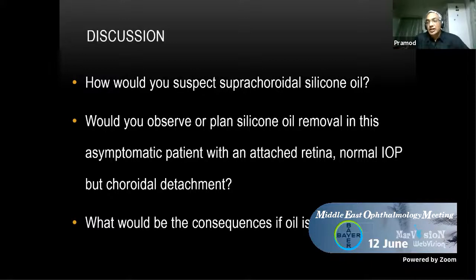Or just before injection, inadvertently, the cannula gets pulled out to some extent. The initial surgery went off well, but inadvertently there is some tug somewhere. But still oil is going into the vitreous cavity, so you are happy, but you don't realize that part of it, because of the oblique entry, is still being injected into the suprachoroidal space. That is the hypothesis I also had. We have 3 cases like this.